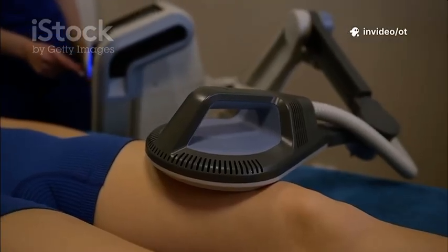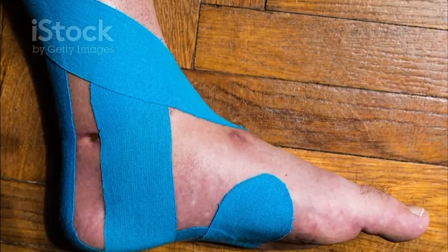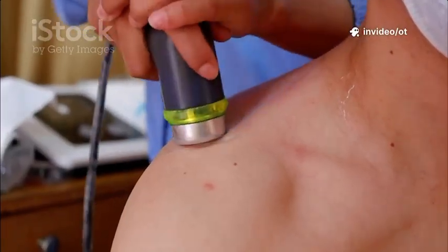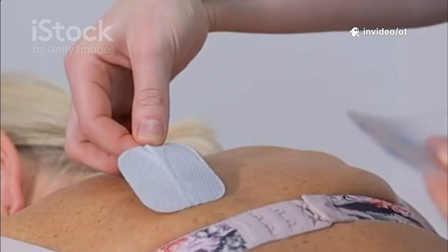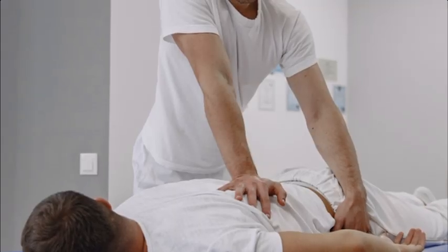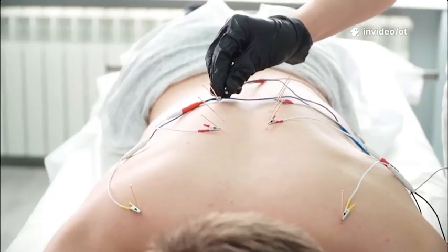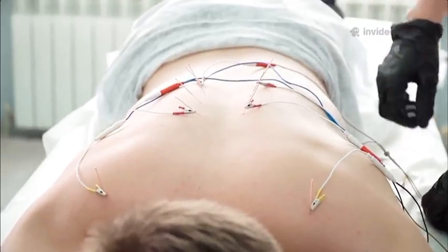Thermotherapy, commonly known as the application of superficial heat, is a modality used to increase the temperature of targeted tissues. This elevation in temperature initiates beneficial physiological effects. Primarily, it causes vasodilation, expanding blood vessels and improving local circulation. Increased blood flow delivers more oxygen and nutrients and helps remove metabolic waste products. The result: reduction in pain, decrease in muscle spasm, decrease in stiffness, and increase in soft tissue extensibility.